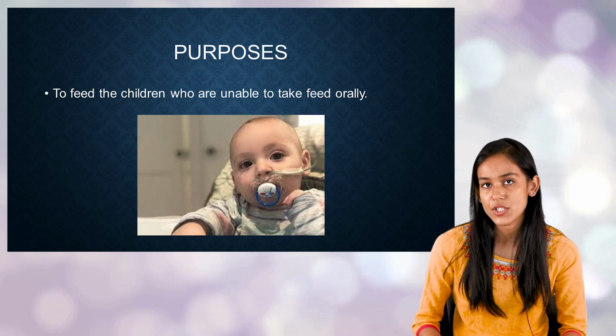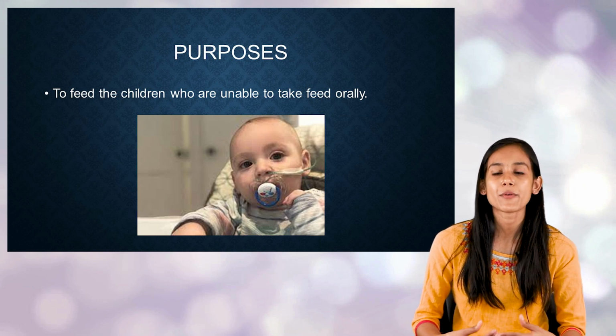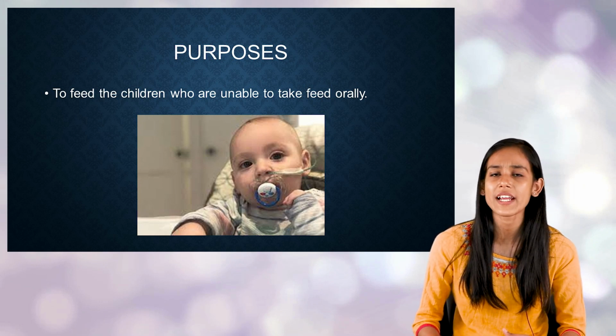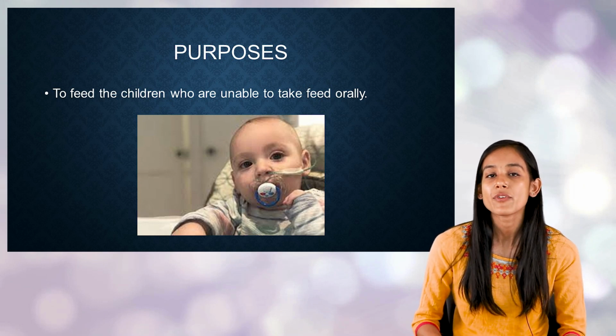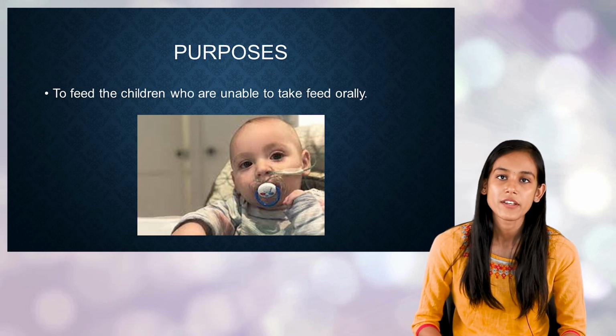Any conditions which inhibit the child from taking food orally, we are going to use nasogastric tube feeding. So in any conditions where the child is incapable of taking food orally, we are going to use this artificial method of feeding.